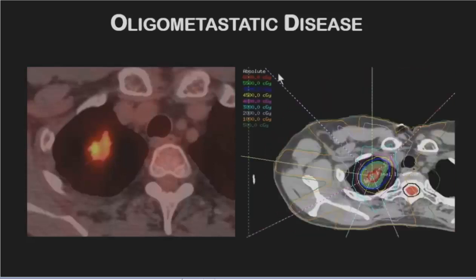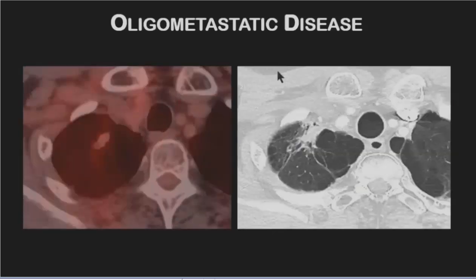So similarly, this patient had their right upper lobe lung cancer treated with radiation therapy, and they had their right adrenal MET resected. And this is a PET-CT follow-up 3 years after therapy, and they're still doing very well and have no evidence of recurrent or metastatic disease.